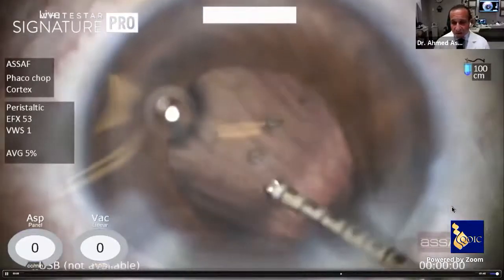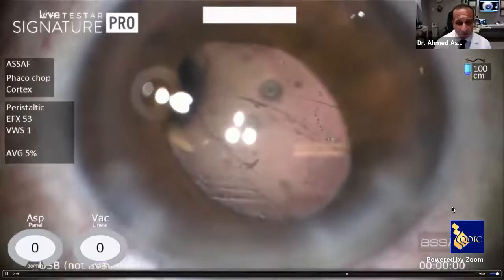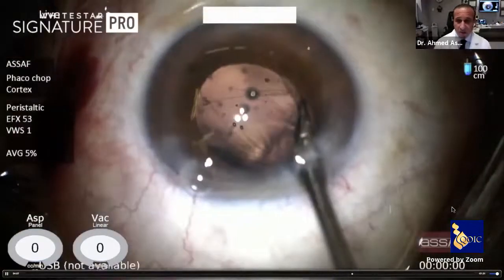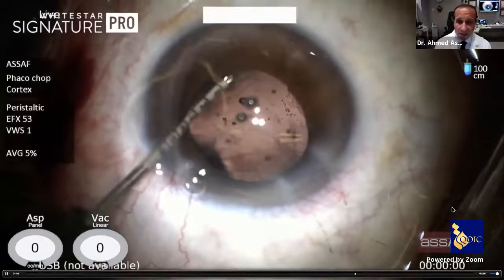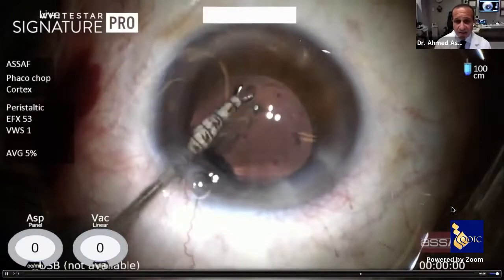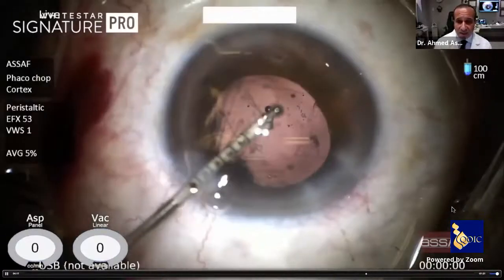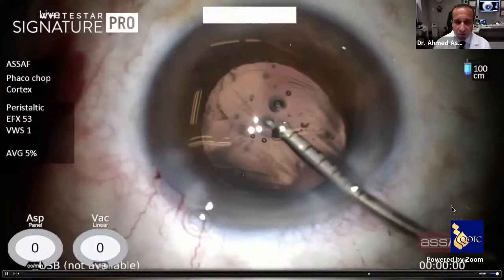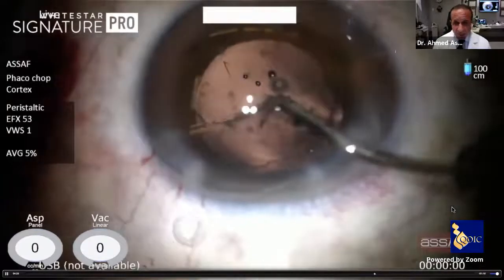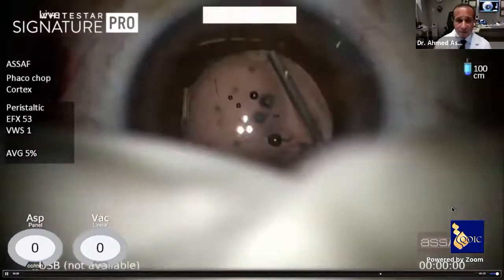But unfortunately, this turned into a break, most probably because it was iatrogenic, or maybe because the lens capsule was already jeopardized from the primary vitrectomy. Anyhow, we can just go forward and try to convert this break into a posterior rhexis. I'm not surprised by this complication because I already have a backup three-piece lens in my hands. And I made my rhexis customized for sulcus implantation with optic capture.